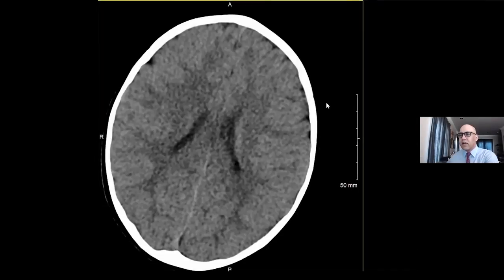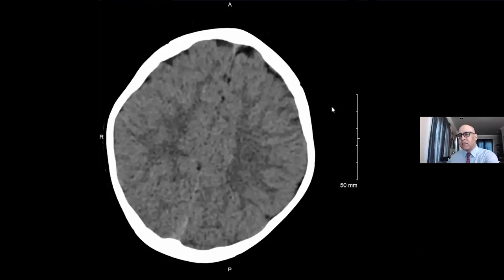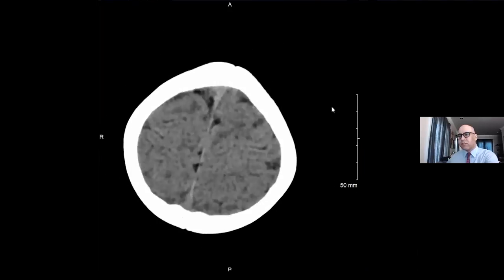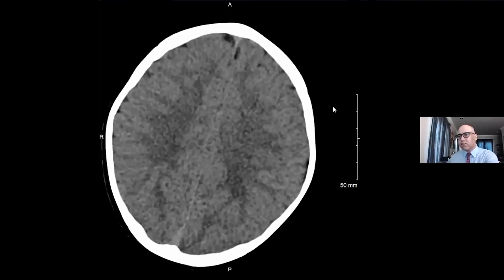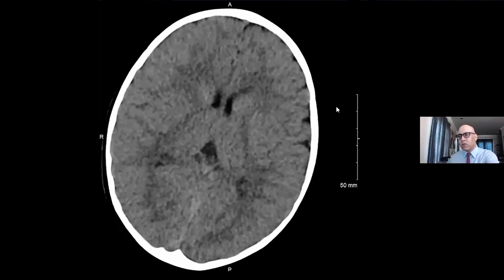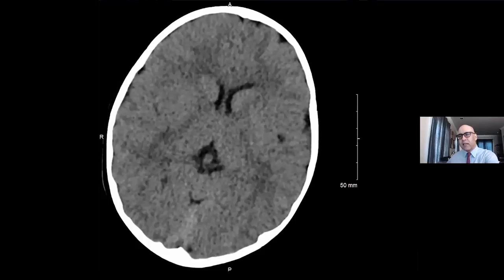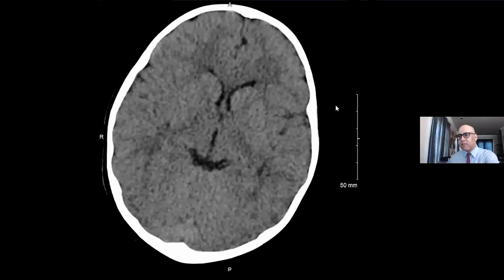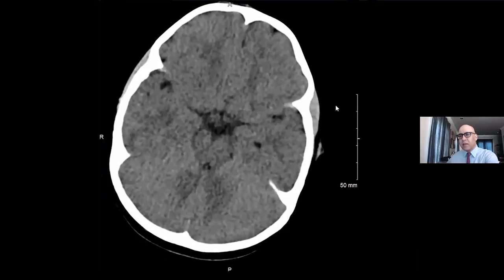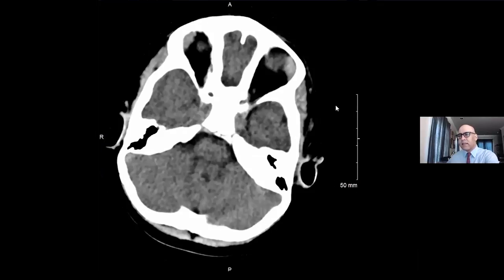This is a head CT on a four-year-old boy with a headache. The head CT, at first glance, looks fairly normal. We're looking through it and we're not seeing any signs of hydrocephalus, any mass, or anything like that.